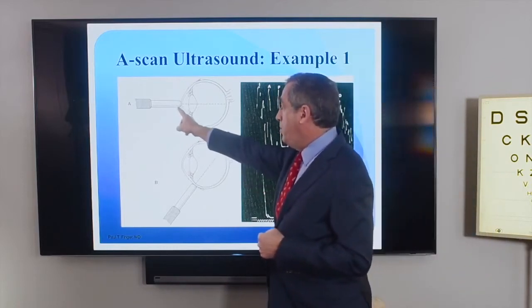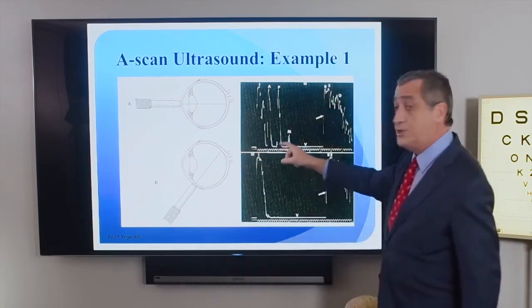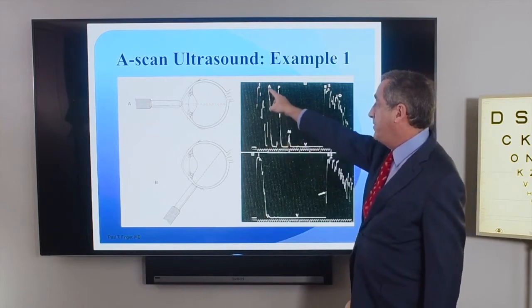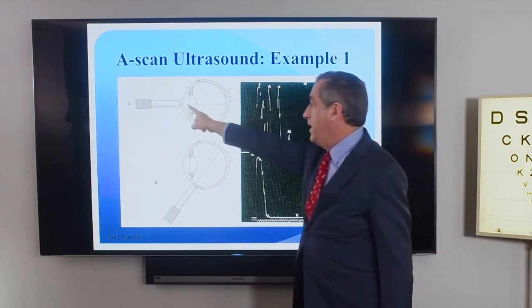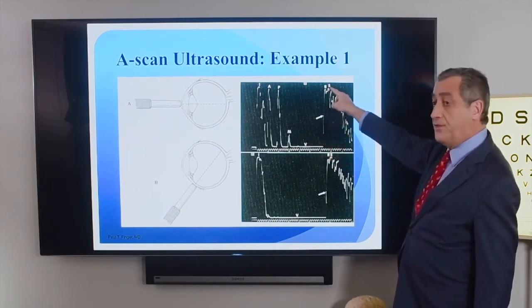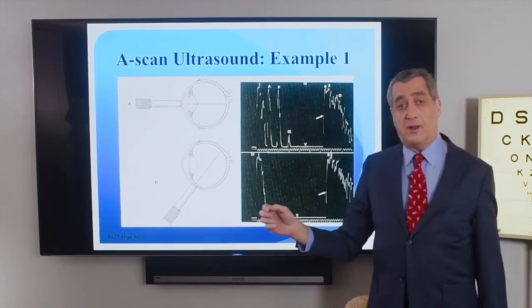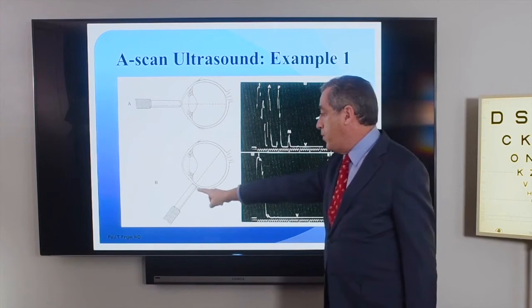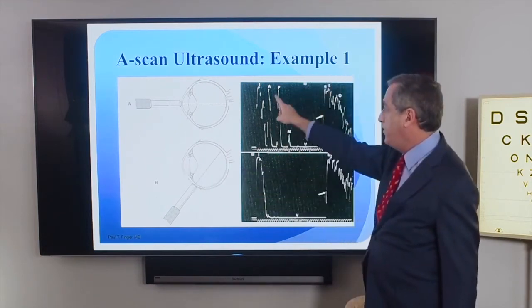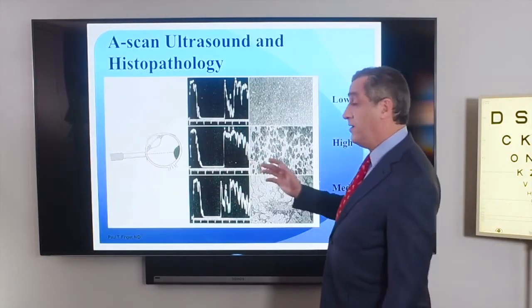Here's an example of the most common use of A-scan. Here's an A-scan probe placed on the cornea. Here's the lens. Here's the back of the eye. Ultrasonographically with A-scan, we see the cornea. We see the anterior lens capsule, posterior lens capsule, anterior, posterior, and then all the way back through the clear vitreous to hit the retina and sclera. These distances can be measured for intraocular lens measurements. If we put this probe through the pars plana, not through the front of the eye, you see that the lens spikes disappear.